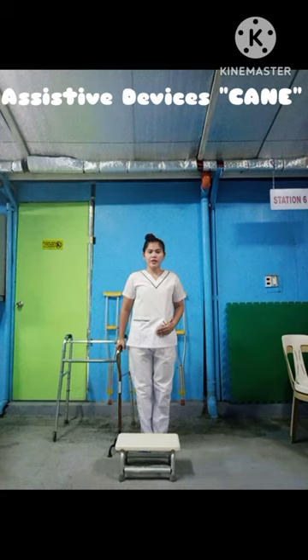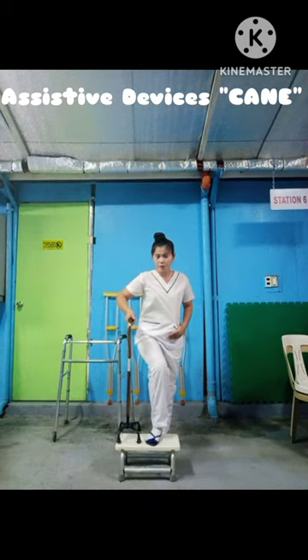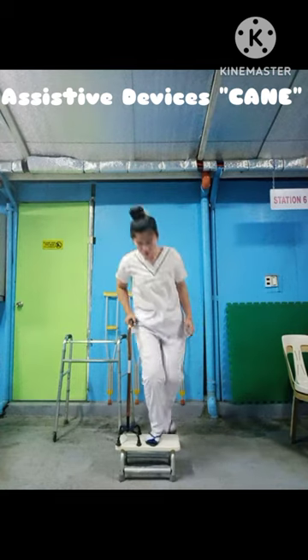Ascending using cane: strong leg, followed by cane, then weak leg.